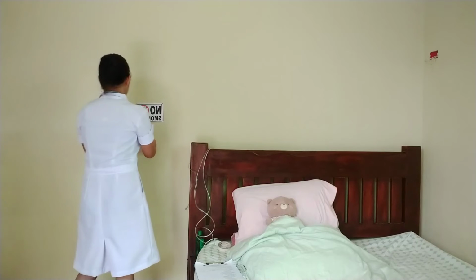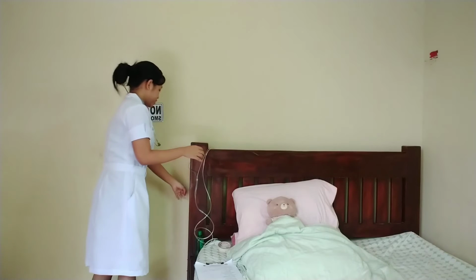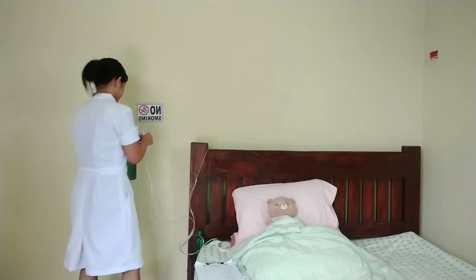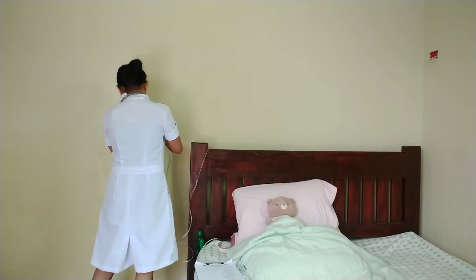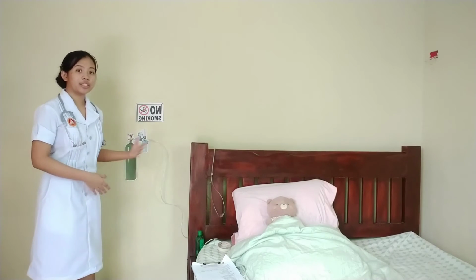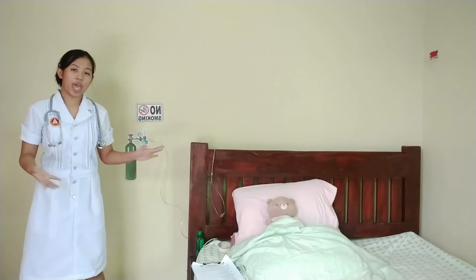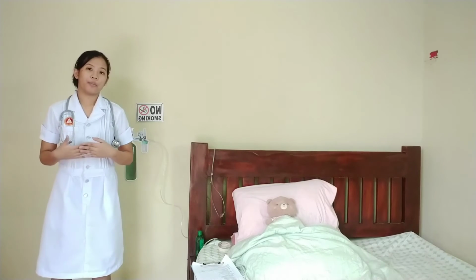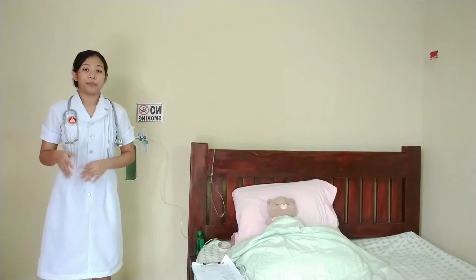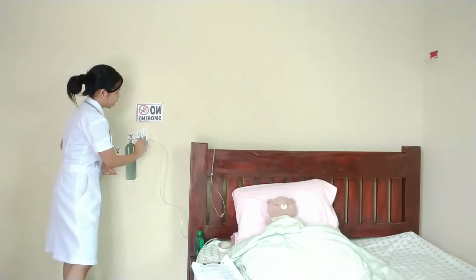So let me just attach it. And then I will attach the oxygen delivery device into the humidifier bottle. So now the equipment, the oxygen, the flow meter, the humidifier bottle, and the tubing is now assembled and prepared. I will now be turning on the oxygen at the prescribed rate, and I will check if it is working or functioning well. So let me just turn it on to the prescribed rate.